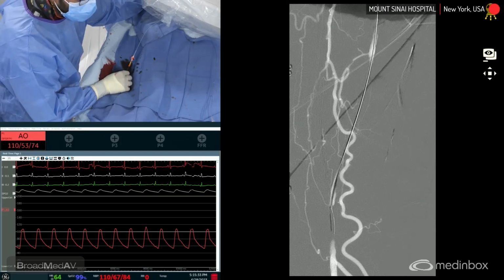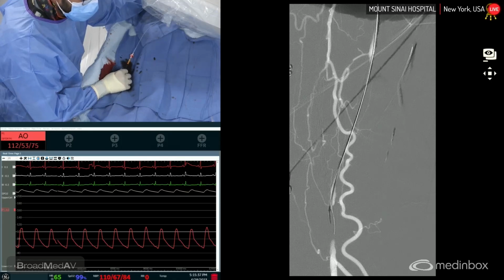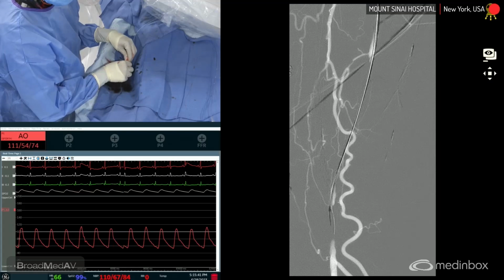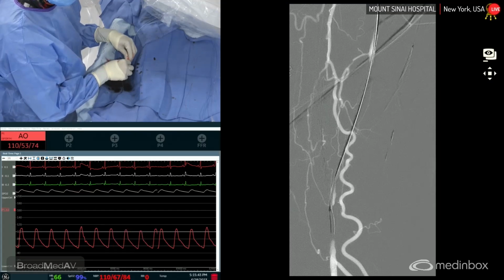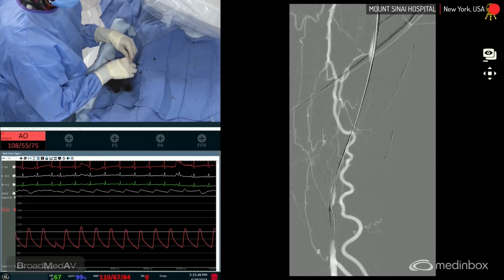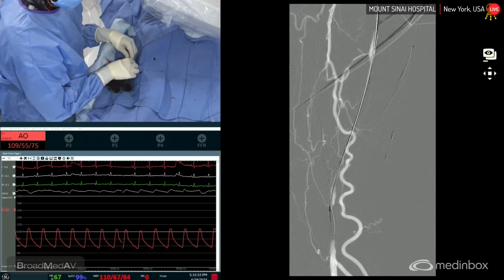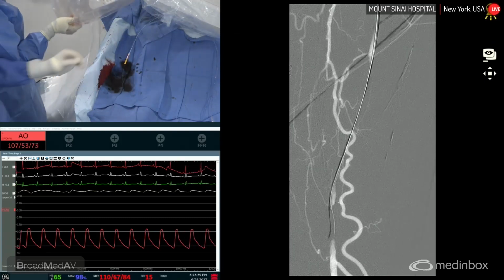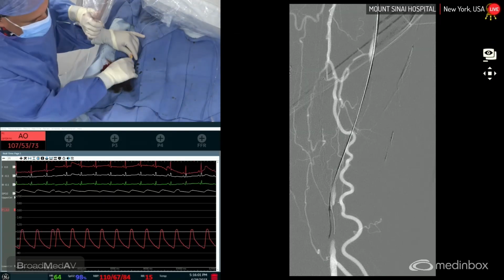So therefore, this is going to be more difficult to cross, because it'll tend to slide off the convexity of the tip and the distal reconstitution segment, and will tend to go off to the side exactly as it's happening. So as he tries a couple more times, we'll probably decide to go with a tip load wire like a Shadow 21. Let me give it a whirl. So we'll try it with a 21, and then we'll try what to do next.